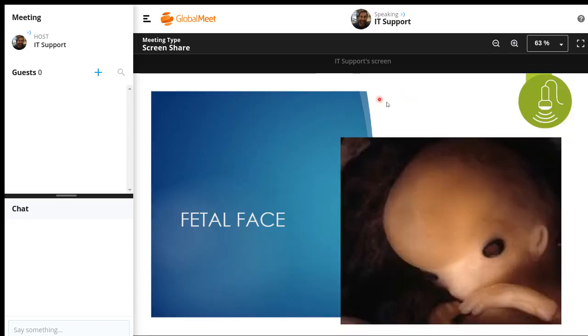All right, so we're going to move on to the fetal face. That was a lot of information, so take breaks as you need to. I just realized that I forgot to put the stars on the slideshow, so when I put it on Canvas, I'll make sure that I edit it and put the stars on the PowerPoint slides that are extra important and could be seen on future board exams.